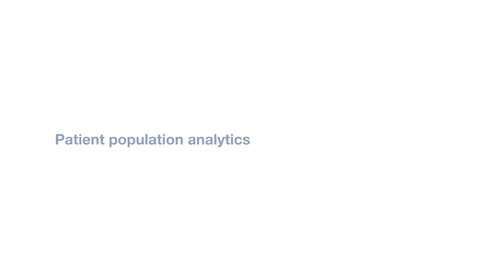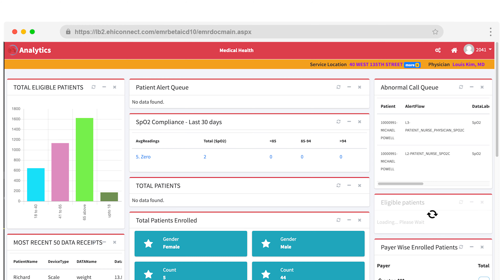Under Analytics, you'll see a complete overview of your patient population. You can see how many patients are enrolled in the program, how many patients are actively using their devices, payer reimbursement amounts, and so much more.